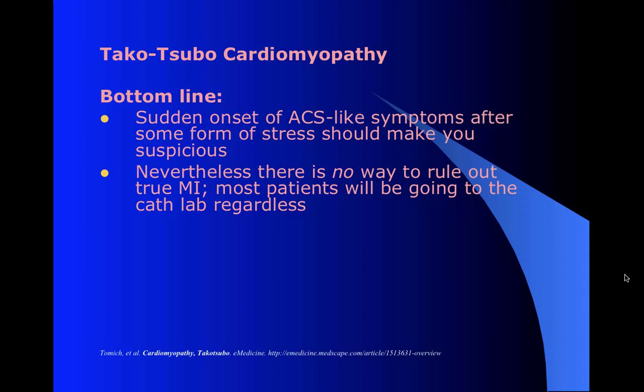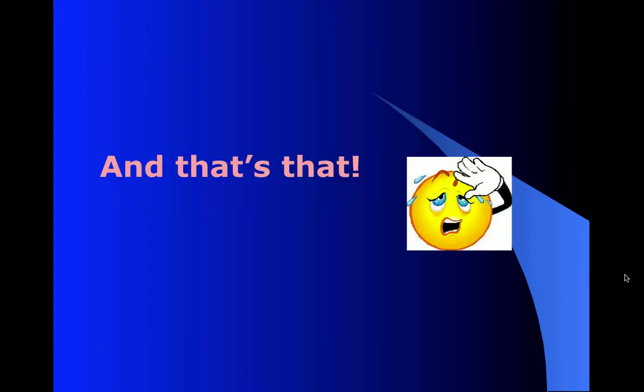But if there is some sort of acute stress, it's something you could think about, but don't worry about it too much. They're still going to get cathed most likely, and that's fine. These are not bad false positives. These are acceptable false positives. All right, and that is the majority of what we're going to look at. Those are all the real common mimics and the general approaches for dealing with them.